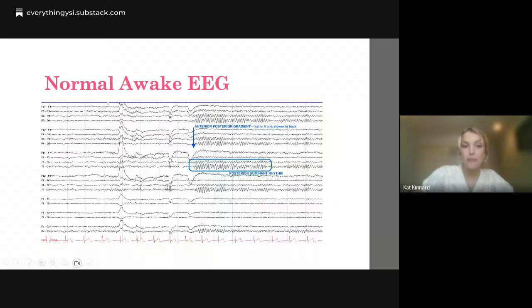You can see these polar movements. That's them opening, closing their eyes. And just notice that this tracing has an organized appearance. It isn't perfectly straight, but it isn't random. There's a rhythmic pattern, particularly if you look in the back. You can see how it's organized.